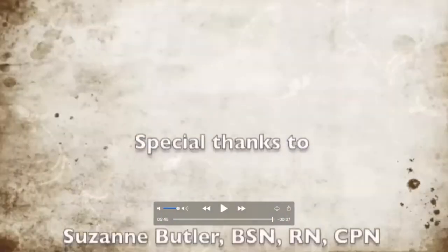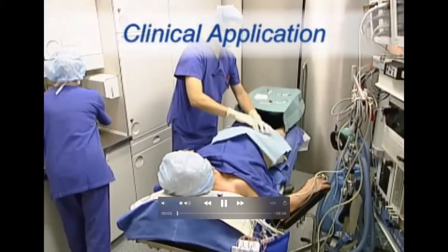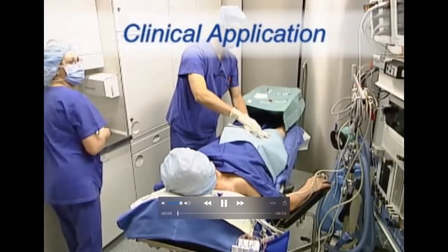Then we need to insert a femoral arterial catheter as well. Yes, there is a separate video for that because that is a whole different procedure. Okay, so we'll see that video as well. Initially, the arterial catheter will be inserted with Seldinger technique. In our example, the place of insertion is the femoral artery.